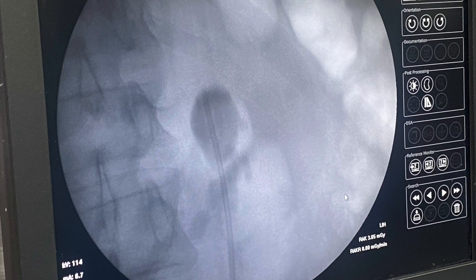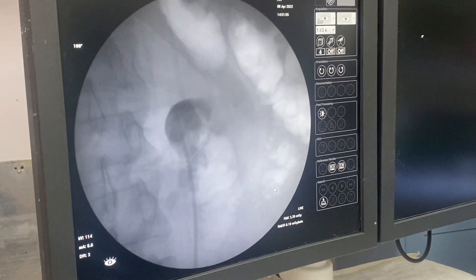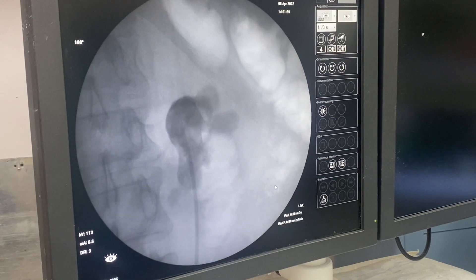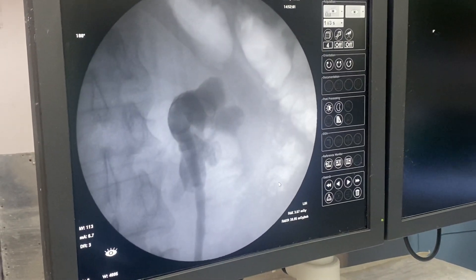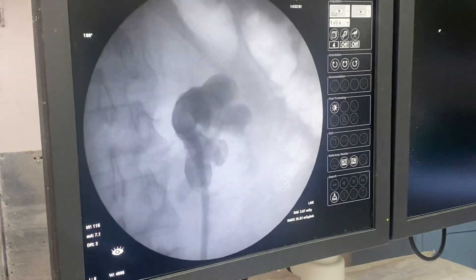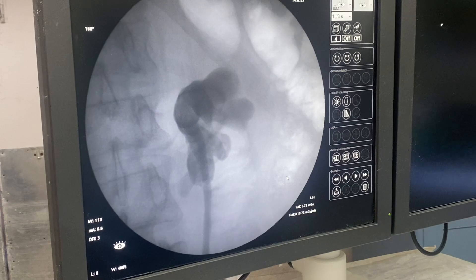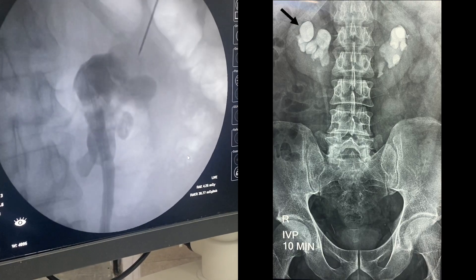After placing a 6-French ureteral catheter in the pelvis in lithotomy position, the patient is subsequently turned into a prone position. An RGP is done initially and you can see the calyces getting opacified slowly in the fluoroscopic image. Initially the lateral calyces are found, but the superior calyx was not well delineated.